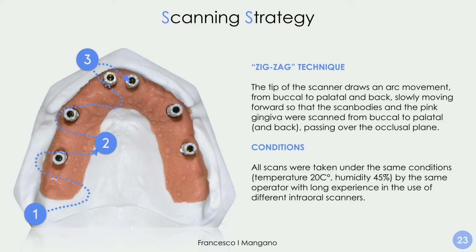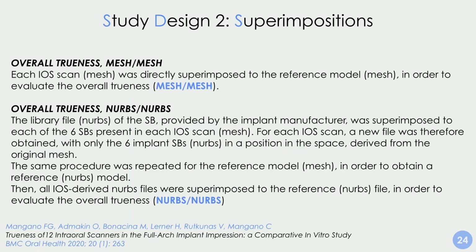The operator was only one, it was me, and all the scans were taken under the same environmental conditions, so the same light condition, the same temperature, humidity, and they were also randomized in sequence in order for the final result not to be affected by operator fatigue.